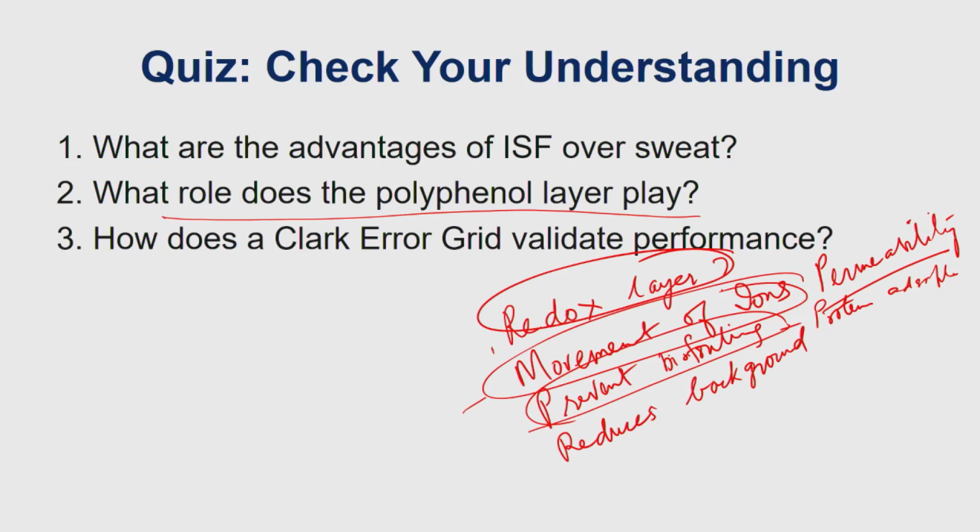So when we insert inside the body, it is stable. It forms conformal layers, which gives the device mechanical stability, so that it doesn't rupture. As I mentioned, if you have anything on top of it which is very thick, there's every chance that you can delaminate it, you can destroy it. Polyphenol definitely helps in maintaining the conformal layer. All right, I think that's all the answers I was looking for.